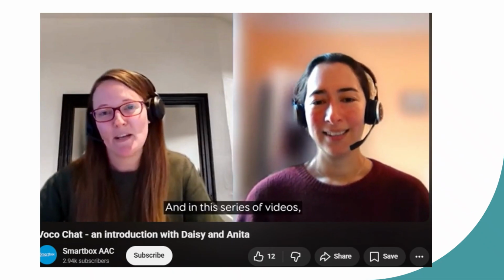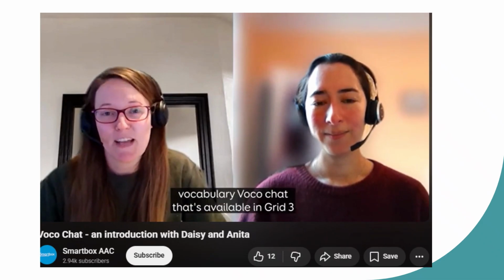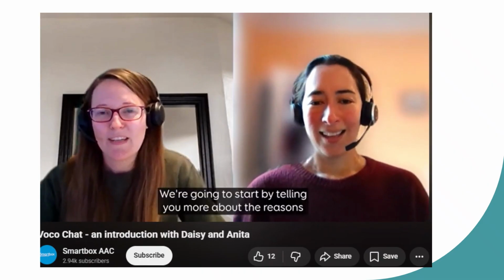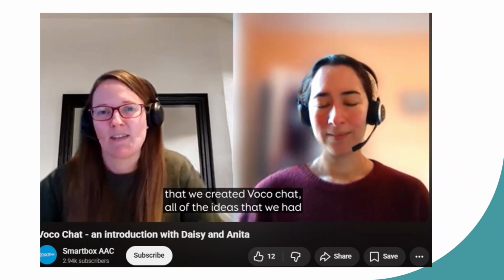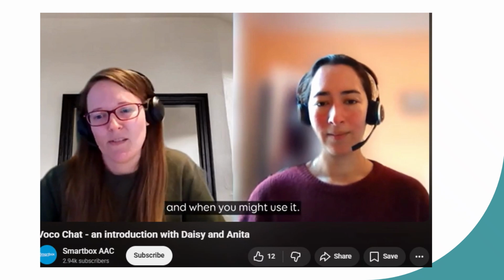And in this series of videos, we're going to be telling you all about the symbol-based vocabulary VocoChat that's available in Grid 3 and Grid for iPad. We're going to start by telling you more about the reasons that we created VocoChat, all of the ideas that we had when we were developing it, who it's for, and when you might use it.